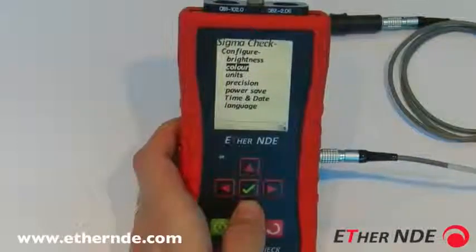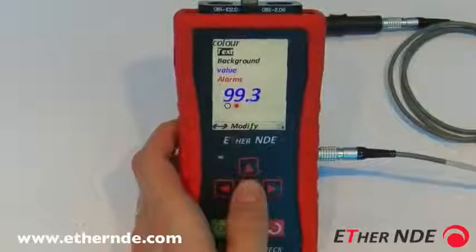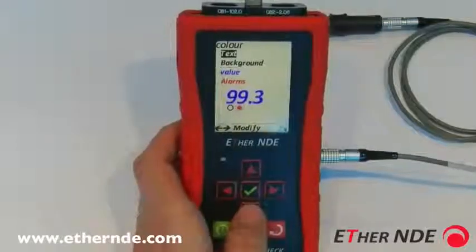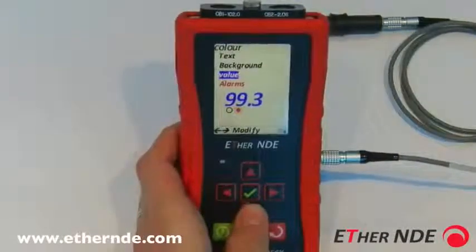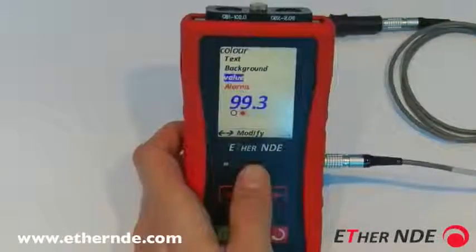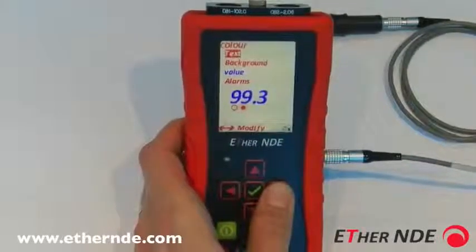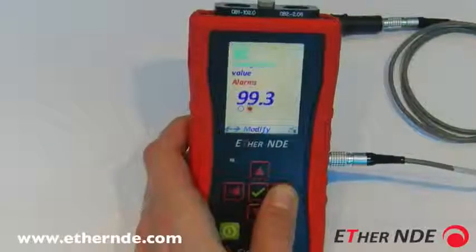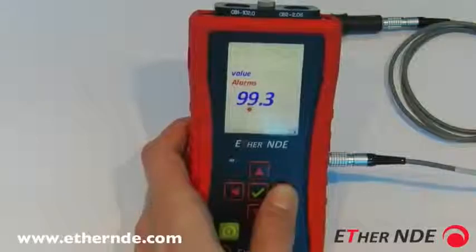How to configure the color scheme of the Sigma Check: under the configure menu we have the menu item 'color'. Selecting color, you can see various options — the color of the text, the background, the color of a value, and the color of an alarm state.